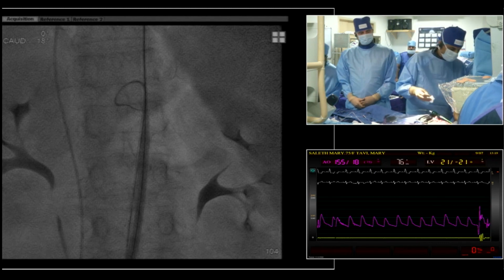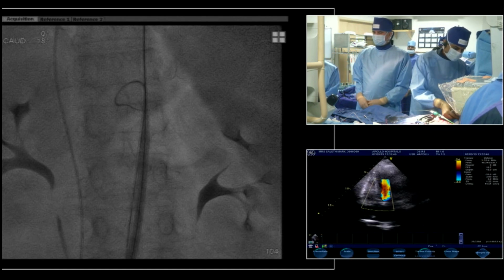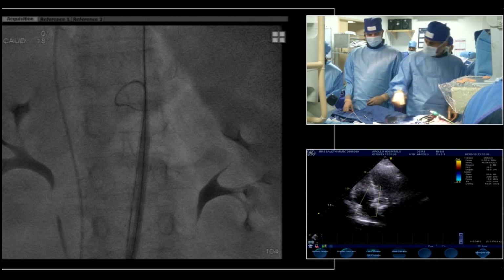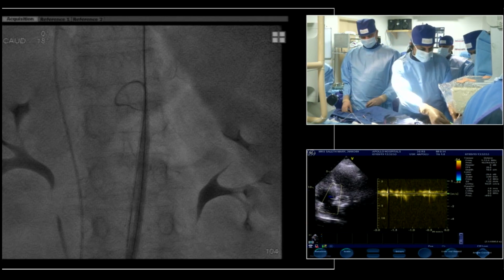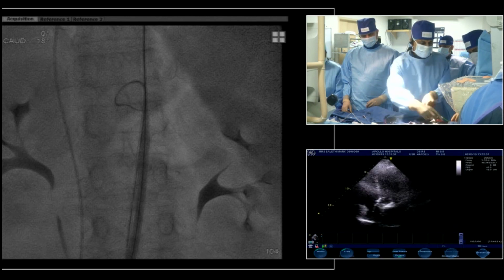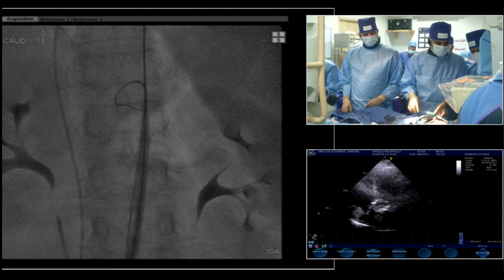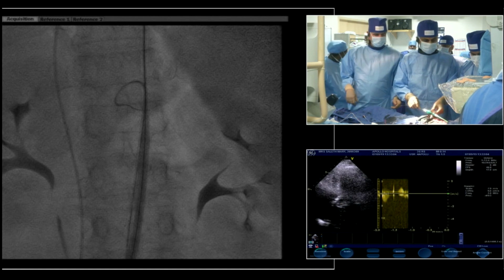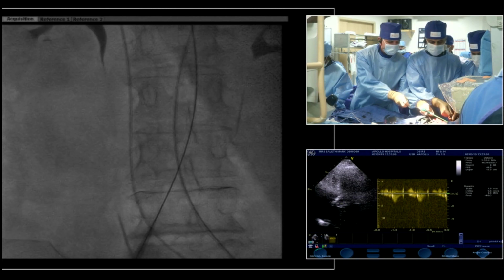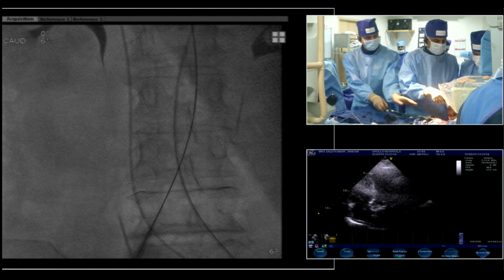So that you have immediate access if needed. But immediate access is also possible because you also have the sheath and the dilator, which if you see any leaks, you just push it back. So the best way is to have the dilator. That's why it's got a dilator. That's why it's got a stiffer wire. Because if there's a perforation, the first step is just push everything back. That seals the perforated artery partially, and then you have time to act.